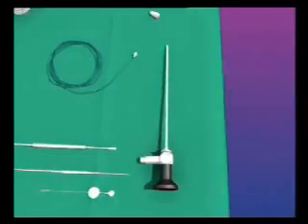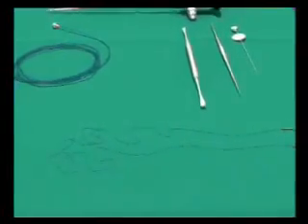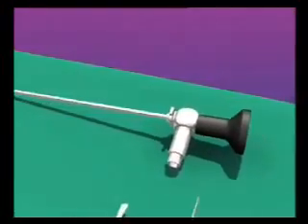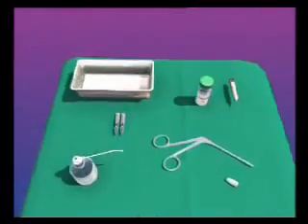With the use of endoscopy and the diode laser, we modified the original surgical technique to obtain a minimally invasive procedure for the lacrimal excretory system. This is done on an outpatient basis with topical and local anesthesia.